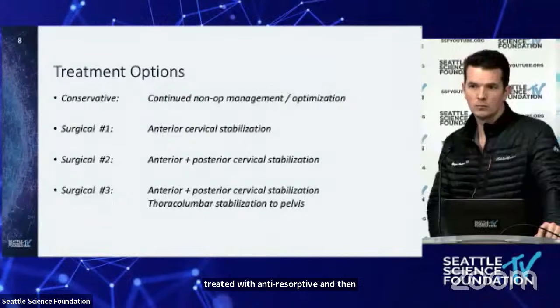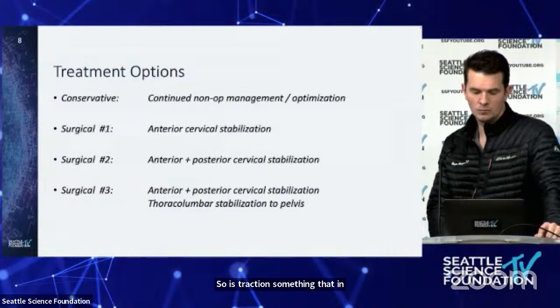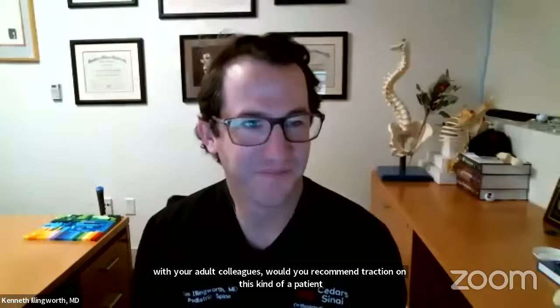So is traction something that in a pediatric analog you would commend? Or if you had a general faculty meeting with your adult colleagues, would you recommend traction in this kind of patient? Okay, if this was a pediatric patient, there's a 1,000% chance they're going into traction. I love traction, and you'll hear it in my talk. I think traction is just an amazing thing, especially for young people.